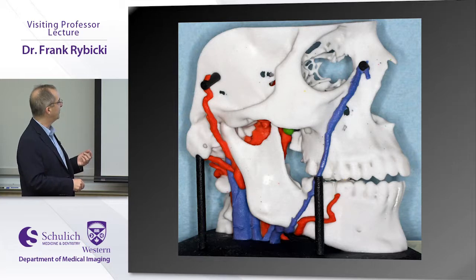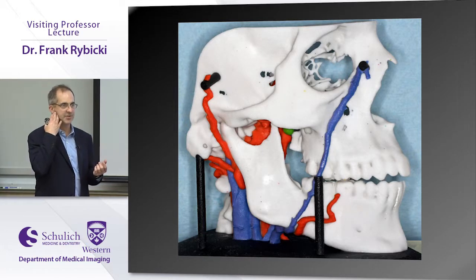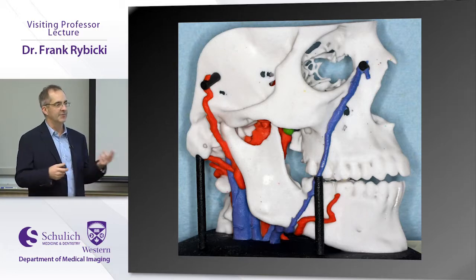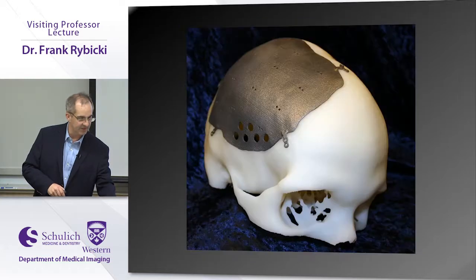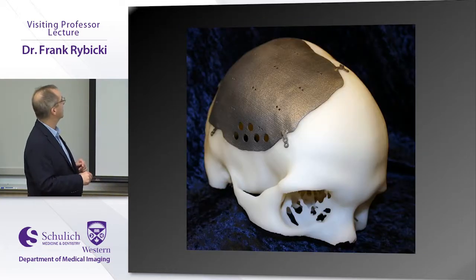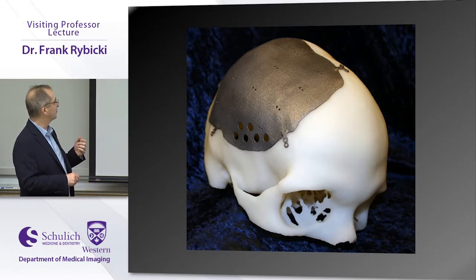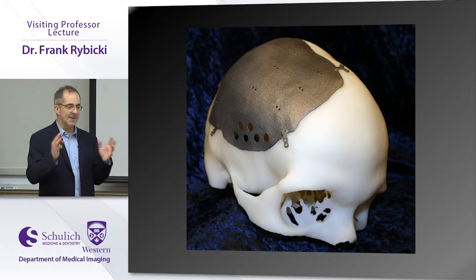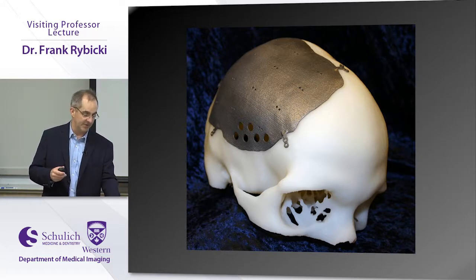Any type of complex surgery that you're going to do, whether in the craniomaxillofacial domain, can be 3D printed. You can print in different colors and plastics. You can do the arteries and the veins, and you can give them to the surgeons ahead of time. This is a 3D printing of a metallic plate to cover a defect. Pre-bending: taking a metal plate in the operating room and trying to bend it and cutting yourself up is, from the surgeon's perspective, a complete non-starter.